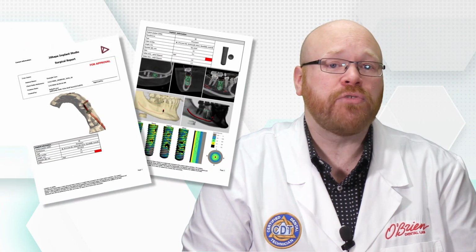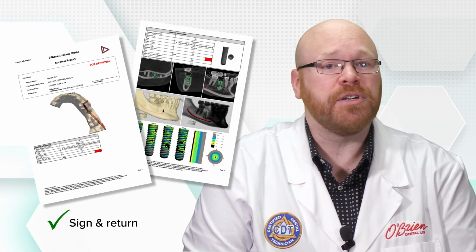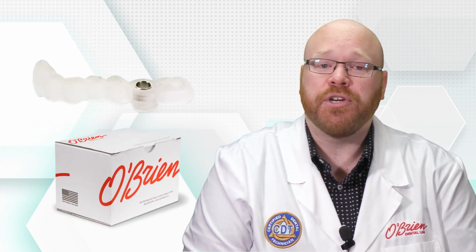Once you have completed the implant planning, we'll send you a final surgical report, which you will need to sign and return to us. At this point, the acrylic guide will be printed, the master sleeves will be added, and the case will be delivered to your office.